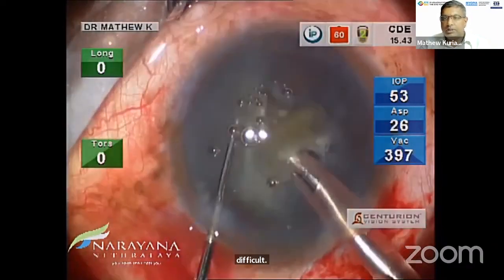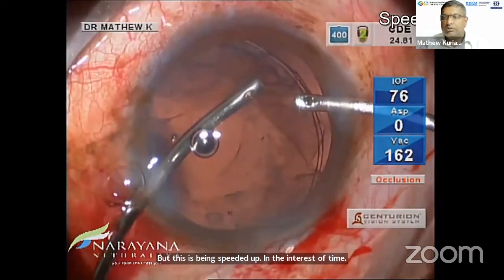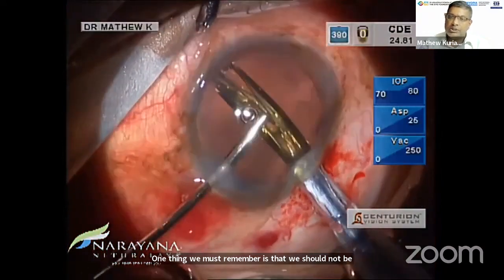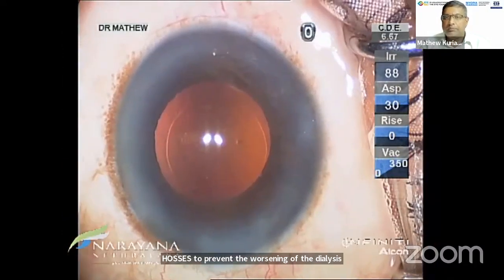So this is being speeded up in the interest of time. One thing we must remember is that we should not be having a centripetal force. We should be using tangential forces to prevent the worsening of the dialysis. Once everything is done, the lens can be placed in the bag.